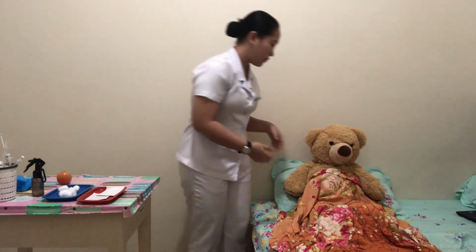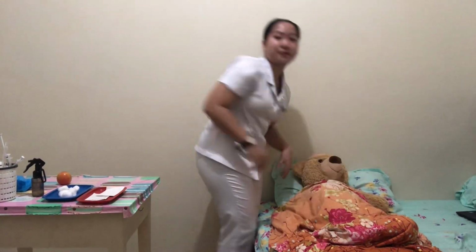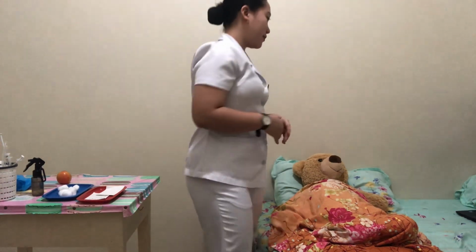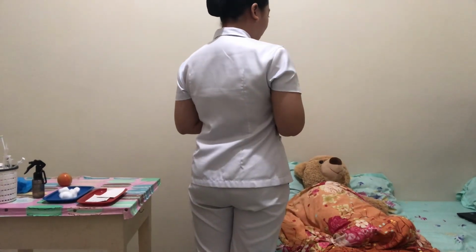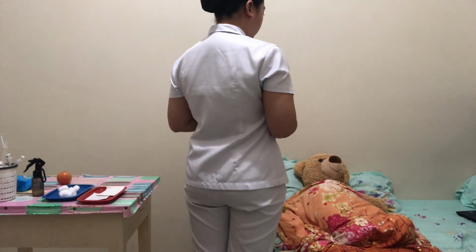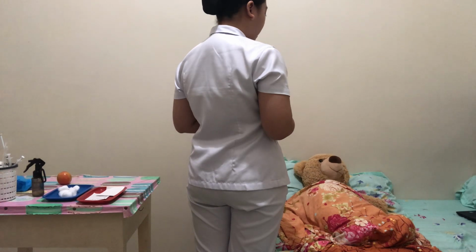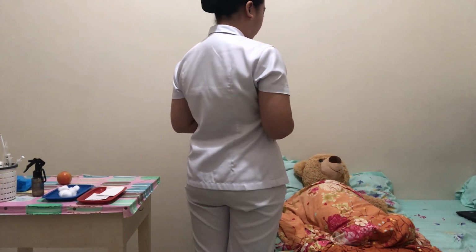The time of the administration, drug name, dose, route, and the client's reaction. And then assess the effectiveness of the medication at the time it is expected to act. Ma'am, we are now done with the intramuscular injection, and I'm going to head out now, so you can take a rest here. So please avoid massaging the area that I have injected with the medicine, and thank you for your cooperation.